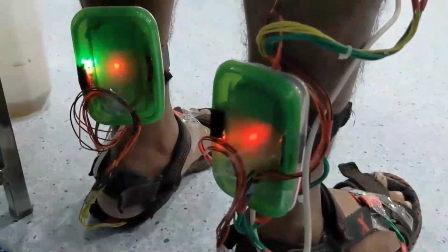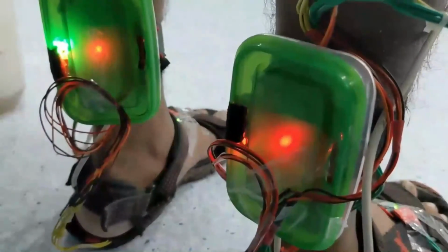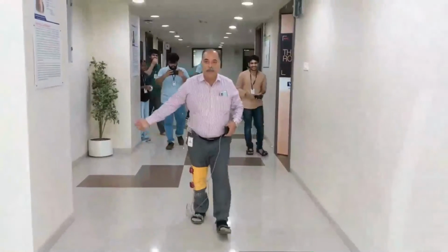These are the indications. Blinking green LED means that the device is calibrating itself. Bright red means Wi-Fi is connected. When the blinking stops, it means it's time to go. And when it's done, the green LED is turned off and the red LED starts blinking. It means data is being transferred to the cloud. When the red LED is off, it means data upload is complete.